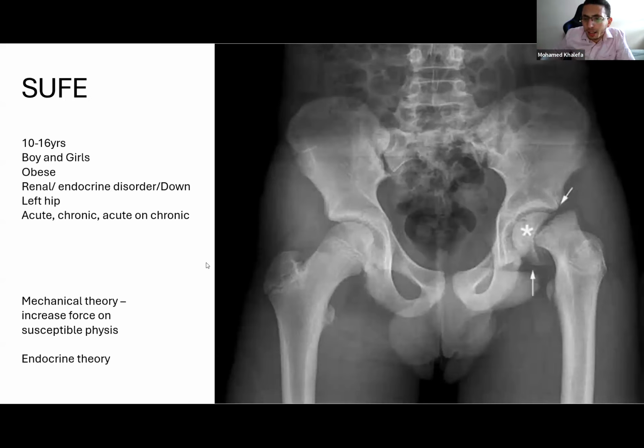Okay. When you ask for an X-ray, they might show this, which looks like a fracture. Again, it's technically a fracture, but it's usually not treated as a fracture. This is slipped capital femoral epiphysis. Again, you will say there is asymmetry. There is a displacement of the proximal physis with proximal migration and external rotation of the limb. Sometimes you can see some callus formation or a bit of irregularity, which means it might be chronic rather than acute. But again, it's difficult to find this on X-ray.